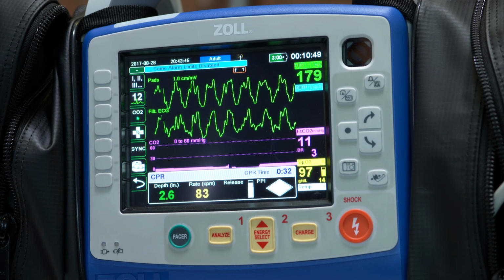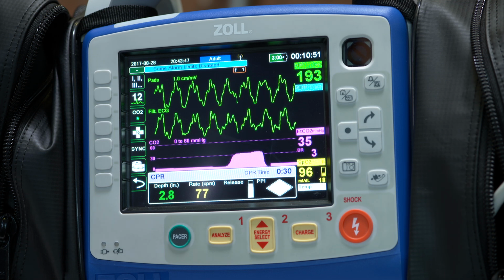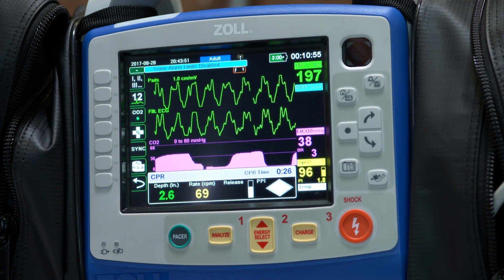So as you can see, if the patient has a good end-tidal CO2 of over 20, then we will choose to defibrillate coarse VFib. We don't defibrillate fine VFib, but we defibrillate coarse VFib. If the end-tidal CO2 is below 20, then we'll withhold defibrillation until we get the patient and their pH and their end-tidal CO2 up to a level where we can appropriately defibrillate and successfully defibrillate.